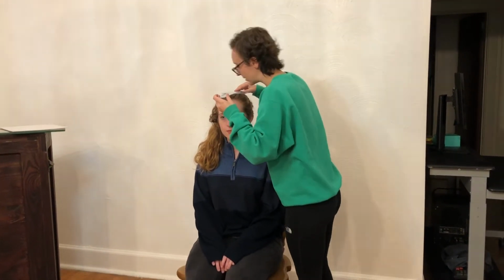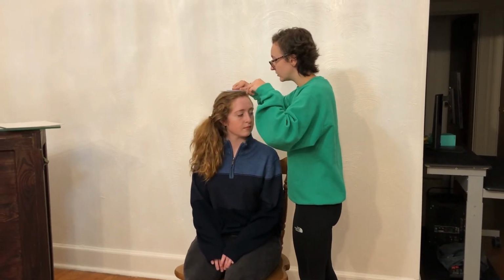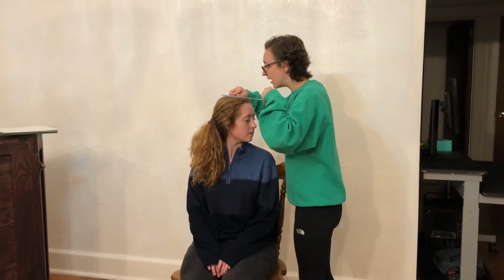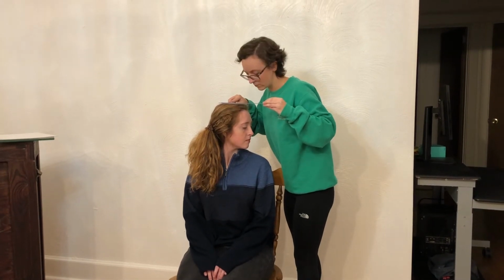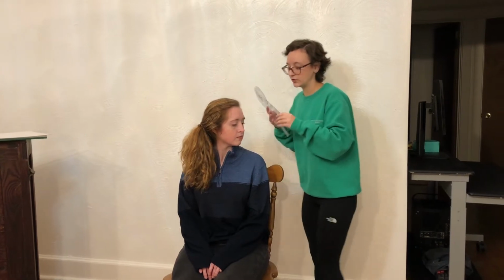Again, lining up with the nose. Go ahead and rotate over to your other shoulder. And great, we've got about 49 degrees of rotation to her left. So this is goniometry of the neck.